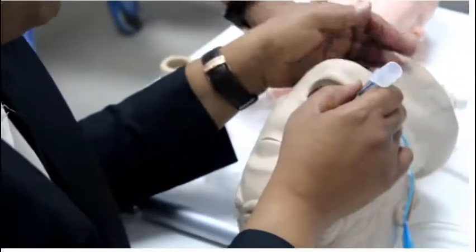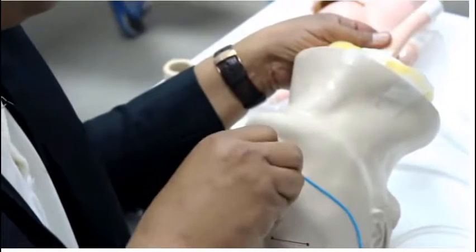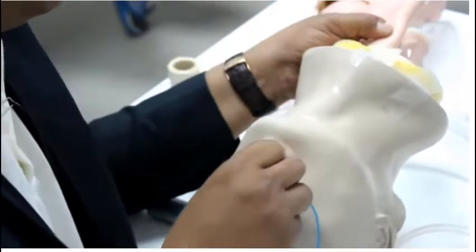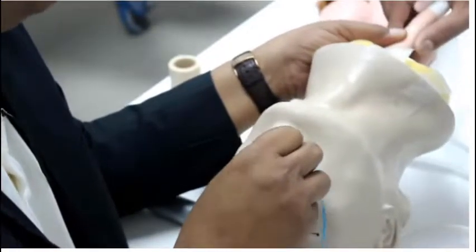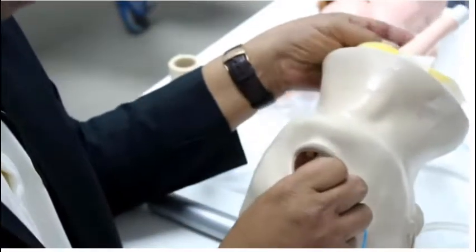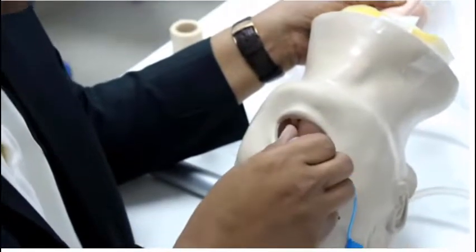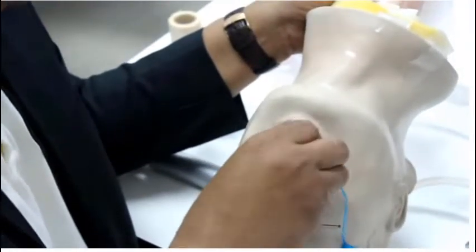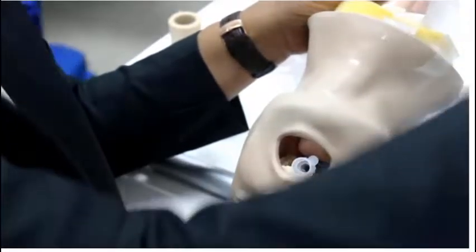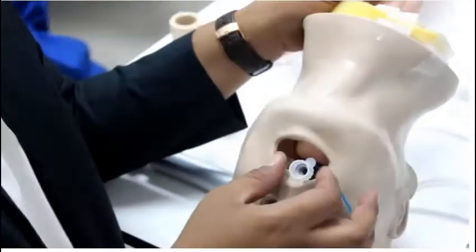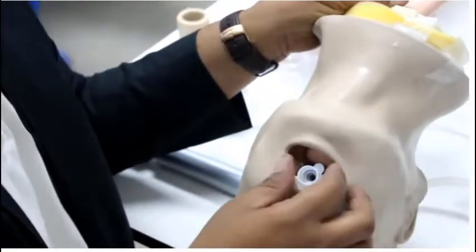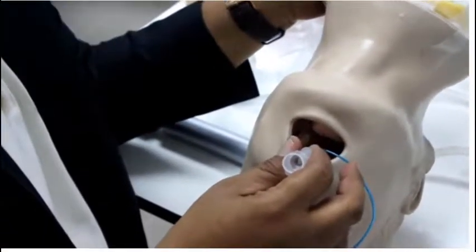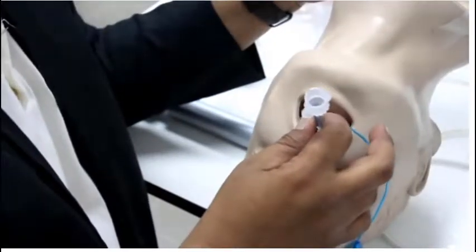If, for example, look here. If you exceed, look now, this is the tube here. Have a touch here. You see the tube here, right? That means I am exceeding the carina. I am in the right side. What shall I do? I'm not going to pull the tube out because the tube is in the right bronchus. I put the stethoscope in the left side and start to pull the tube out step by step and inflating my Ambu bag. When I start to hear air in the left side, the left lung, that means the tube is in the mid-tracheal way. This is important.